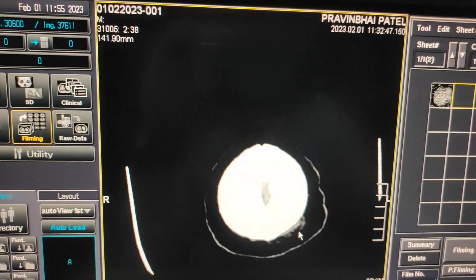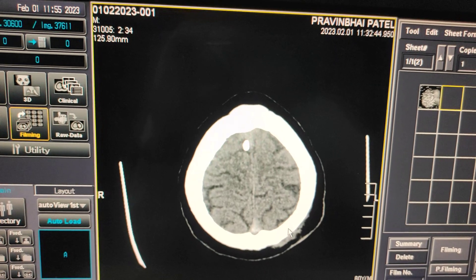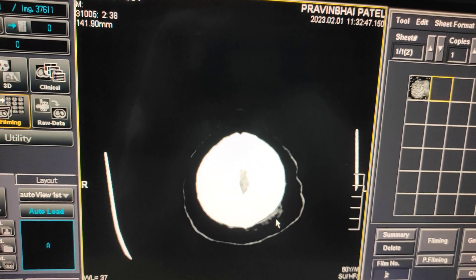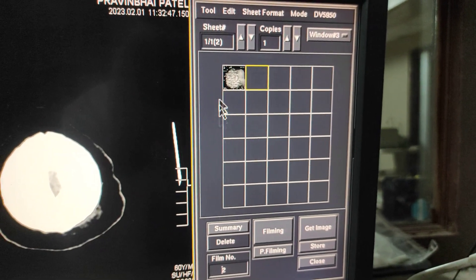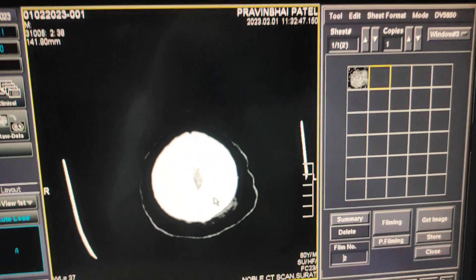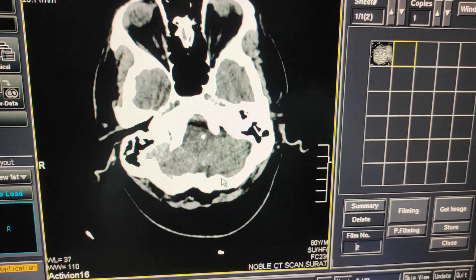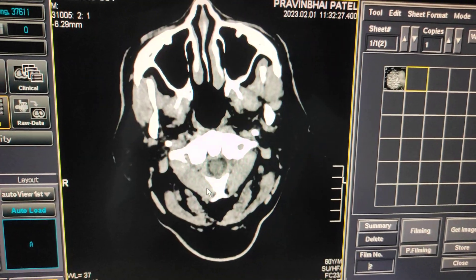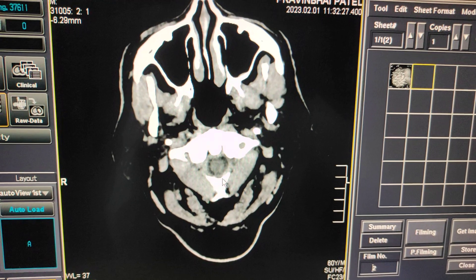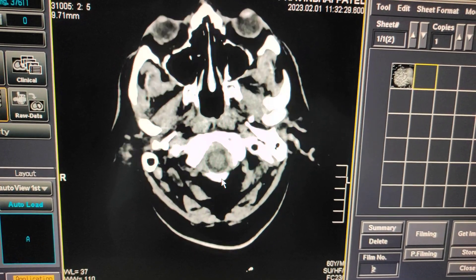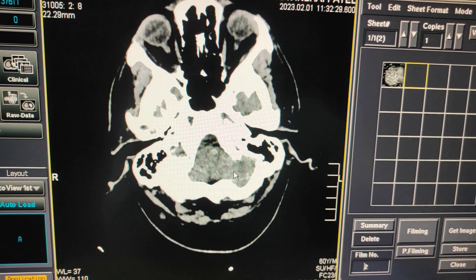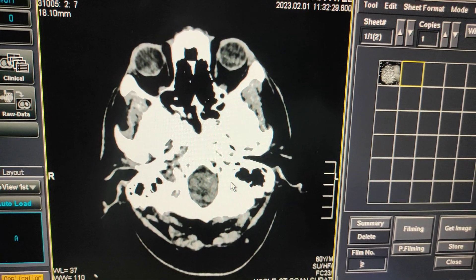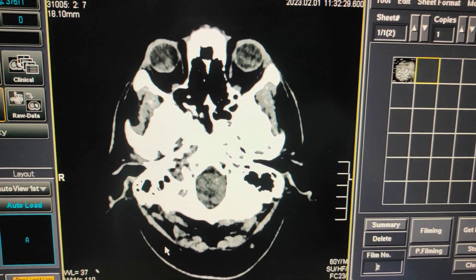Now calculate the images you have taken. I scanned in 3mm, so images are 37-38, but you have to adjust to 29 images because the first image is the scanner. I'll do it from here — this is the base of the skull. From 7 images taken from the CV junction, these images are not useful in the film. The cerebellum and medulla start here, so the first image should be from this level when you are doing brain filming.